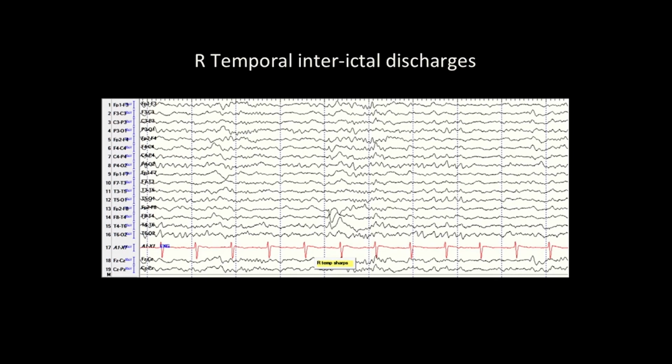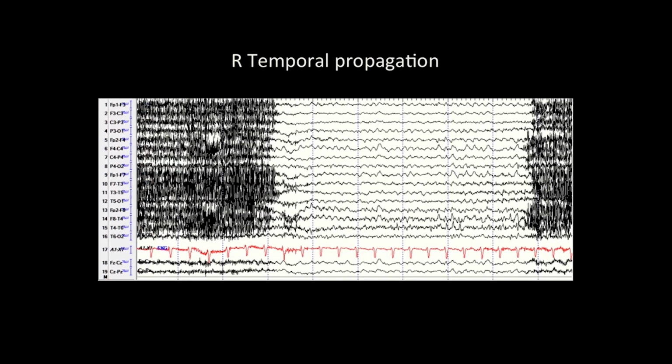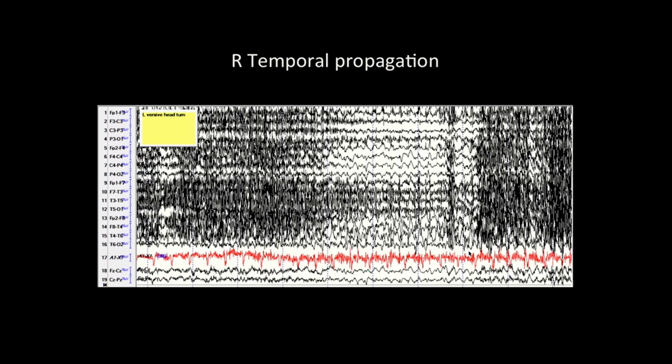So this is her scalp recordings, where you see that she has right temporal discharges. This is her seizure onset, which suggests a right temporal onset and propagation of her seizures. This is the propagation part, a little clearer here, where you see a right temporal ictal pattern. And then this is followed by progression towards generalization, all from the right temporal lobe.